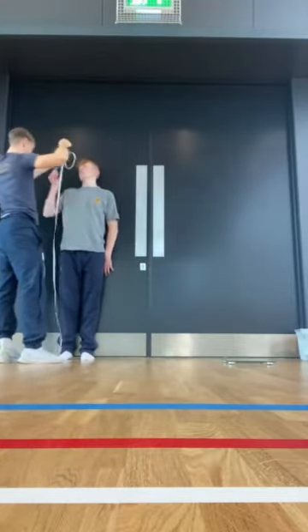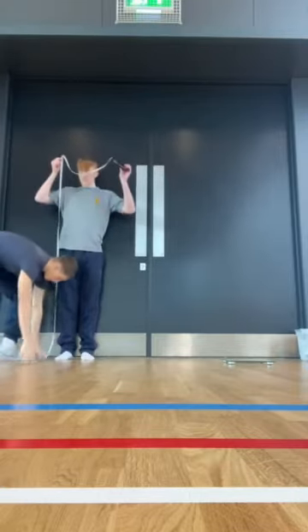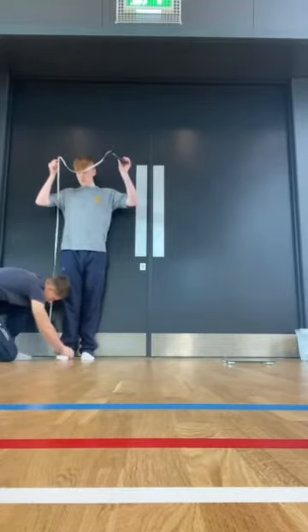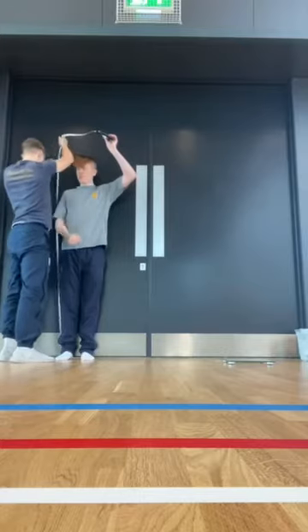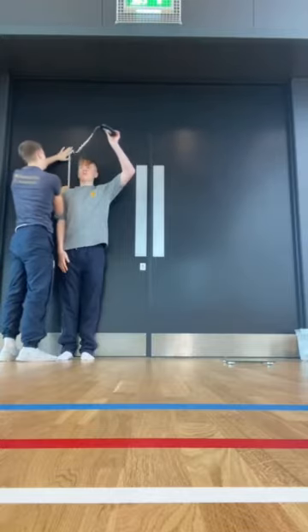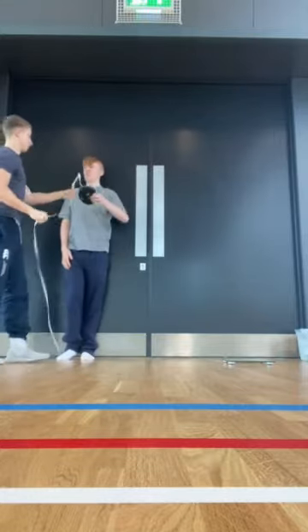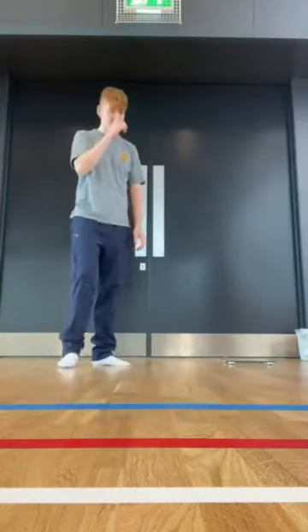Can you see how this is in a second? I'm just going to put this up here. And you are 184 centimeters — so 184 centimeters and 74.6 kilograms.